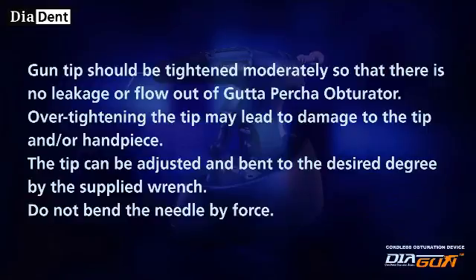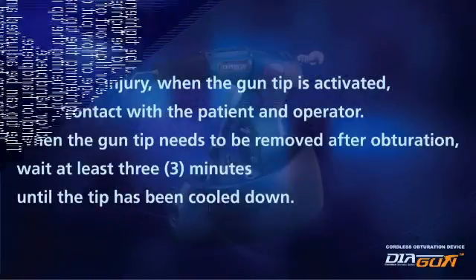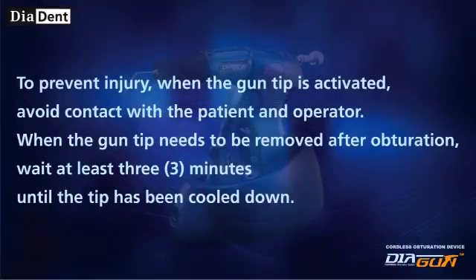Overtightening the tip may lead to damage to the tip and/or handpiece. The tip can be adjusted and bent to the desired degree using the supplied wrench — do not bend the needle by force. To prevent injury when the gun tip is activated, avoid contact with the patient and operator. When the gun tip needs to be removed after obturation, wait at least three minutes until the tip has cooled down.